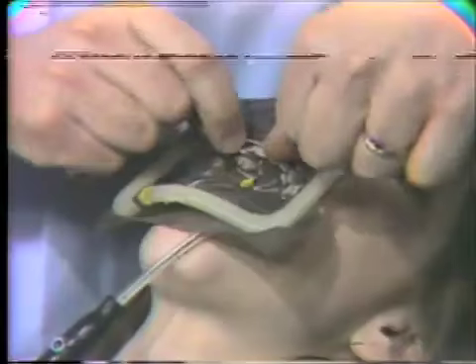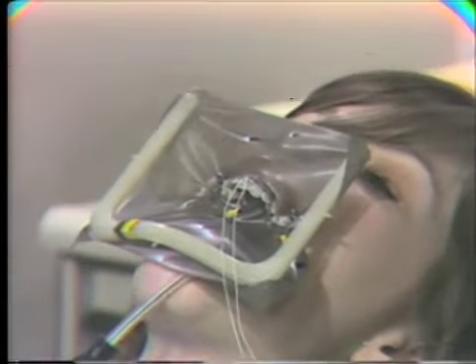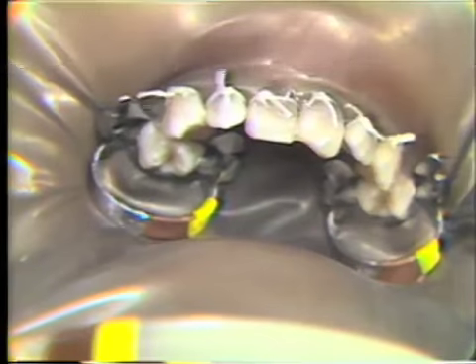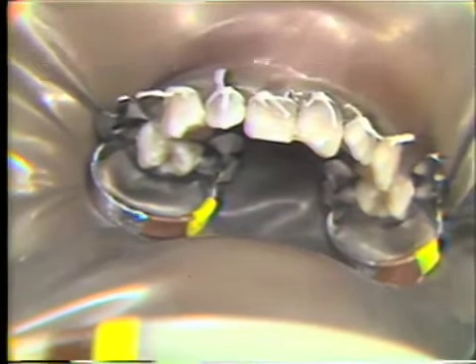Okay. Here we got one ligation on. Now let's go on to the next central incisor. The ligation of the 6 anterior teeth is now complete.